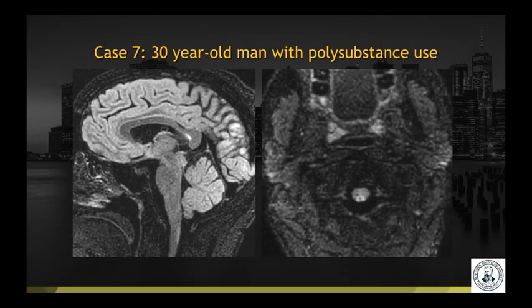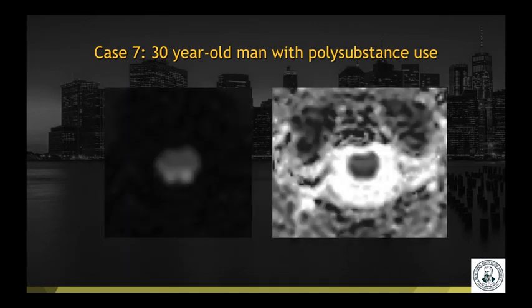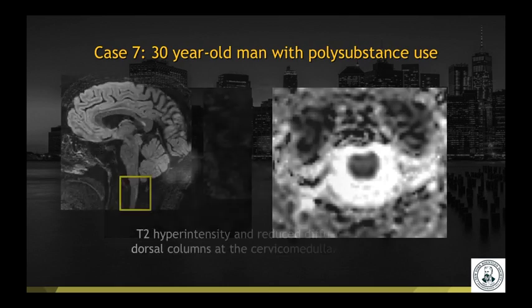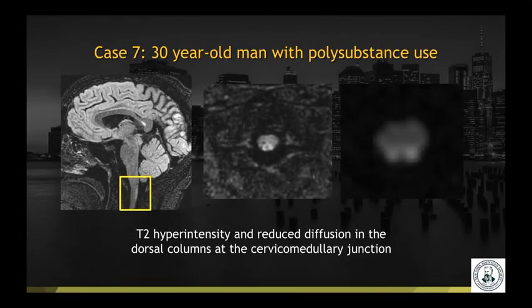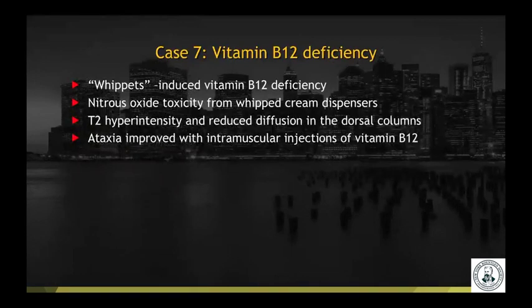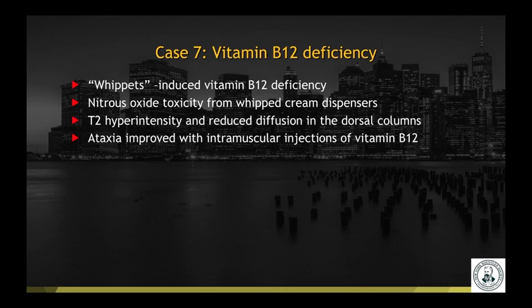Case number seven: a 30-year-old man with polysubstance use. Sagittal and axial T2 FLAIR images and diffusion with ADC map demonstrate T2 hyperintensity and reduced diffusion in the dorsal columns at the cervical-medullary junction. This was a case of vitamin B12 deficiency, in this case induced by whippets — nitrous oxide toxicity from inhaling whipped cream dispensers. Classically, you get this T2 hyperintensity and reduced diffusion in the dorsal columns. Patients often present with ataxia, which improves with intramuscular injections of vitamin B12.